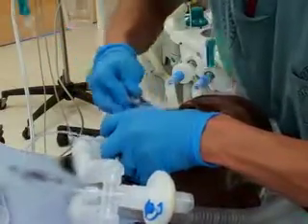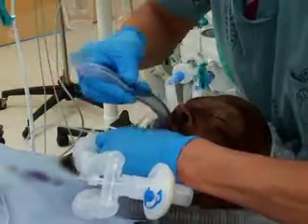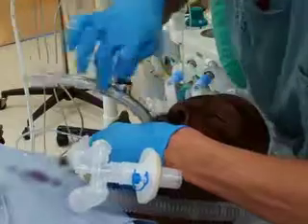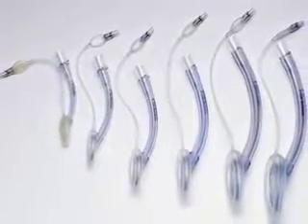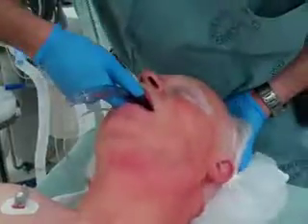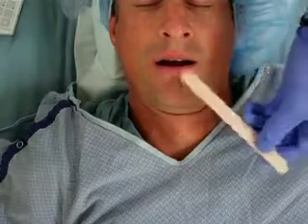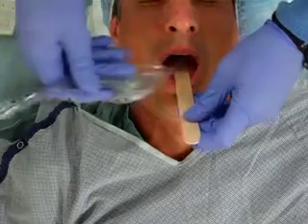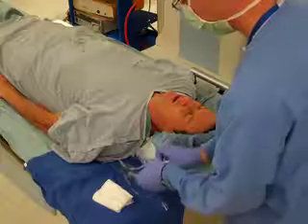The most common location of obstruction is at the level of the oropharynx, either because the epiglottis has folded down or because the tongue or redundant oropharyngeal tissue is pushed into the airway. Selection of the proper size laryngeal mask airway, as well as use of proper insertion technique, will reduce the frequency of these problems. Use of a tongue blade to partially retract the tongue and to provide counterpressure against the hard palate is one way to improve entry of the laryngeal mask airway into the mouth.